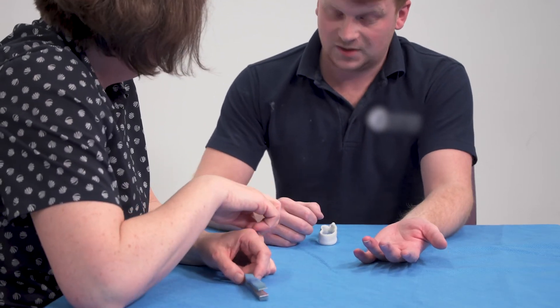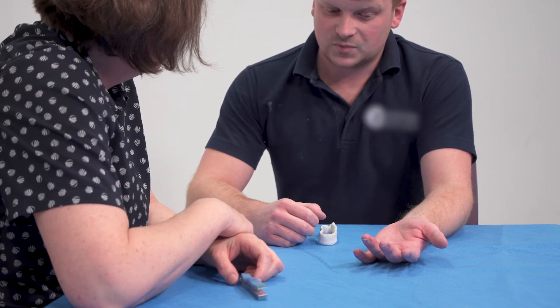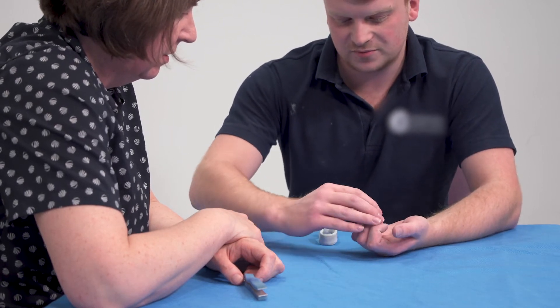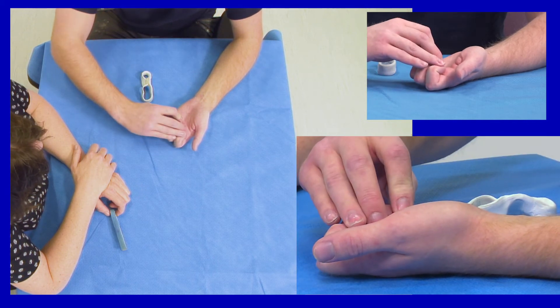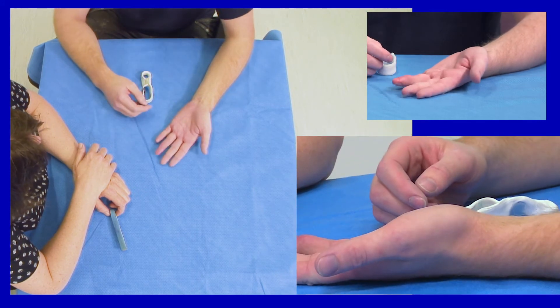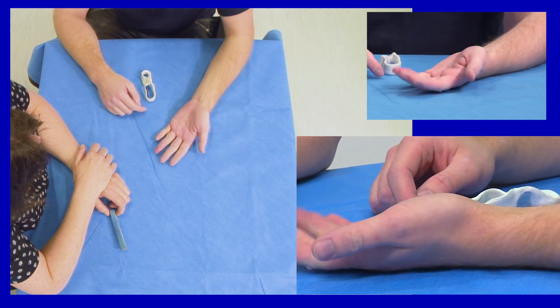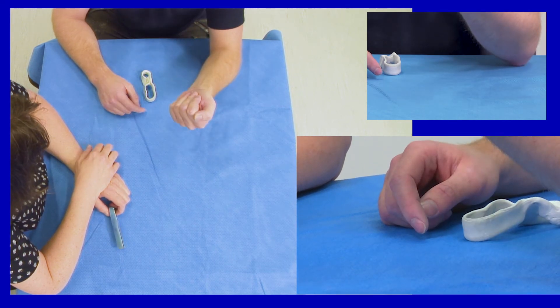You're four and a half weeks now. Did you have different exercises at an earlier stage? Yes — previously I had to use my other hand to just bring them into a claw at the end, just to get them moving. Once I'd loosened them up, I was then making a claw with that hand five times, and then the other one was like this — all up here like so.